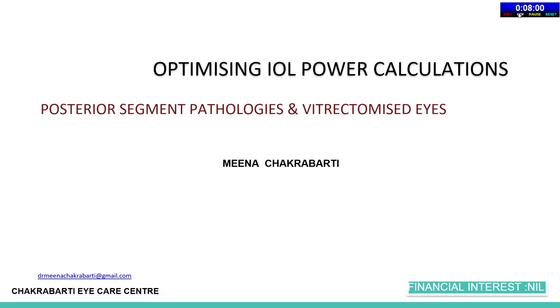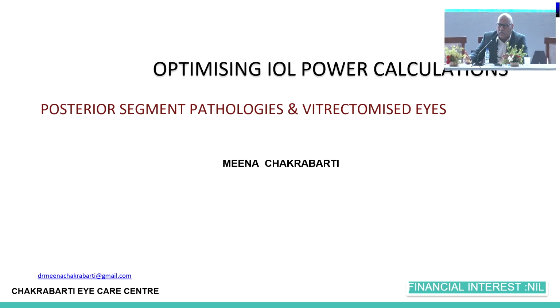That was adopted by the ESCRS website, and I think we should be using it as a free formula. If you go to the website, you get it free of cost. Transcription errors have to be avoided, but I think it is a very good formula too, and serves all kinds of purposes. It's a kind of IOL power suite.